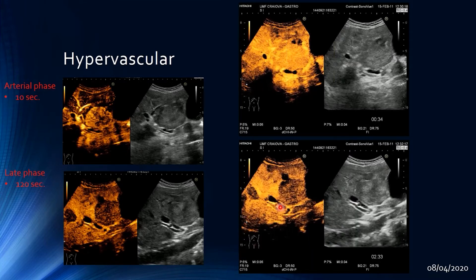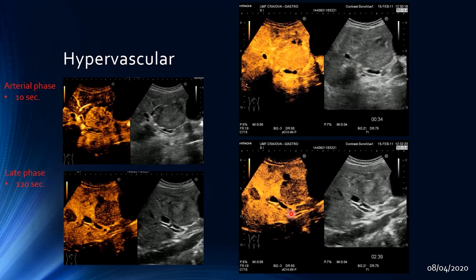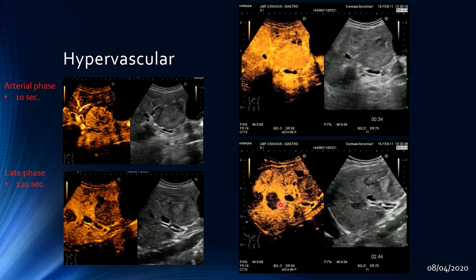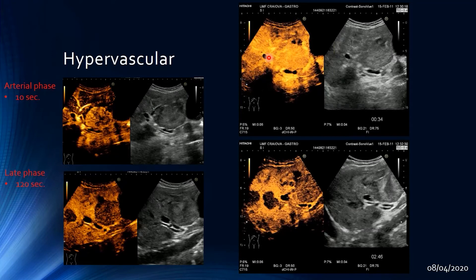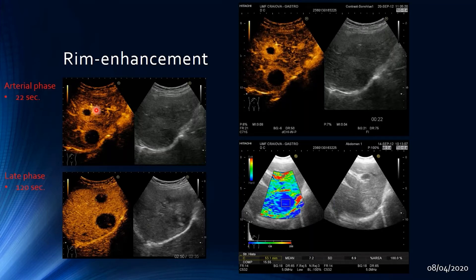These lesions in both liver lobes were metastatic lesions from a primary neuroendocrine tumor of the pancreas — a quite characteristic appearance. Another example demonstrates ring-like enhancement of two lesions at 22 seconds post-injection, both washing out in the late phase after 120 seconds. Elastography showed the lesions to be quite hard with low strain.